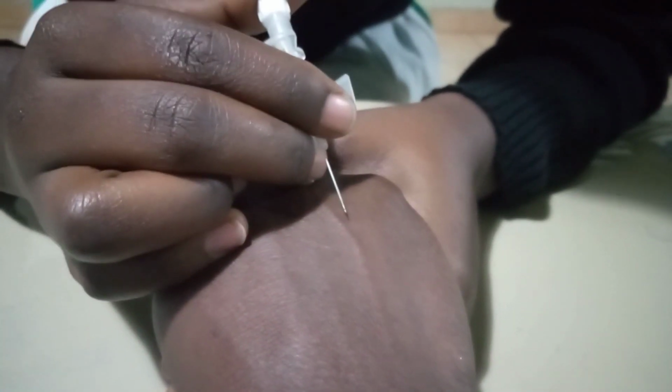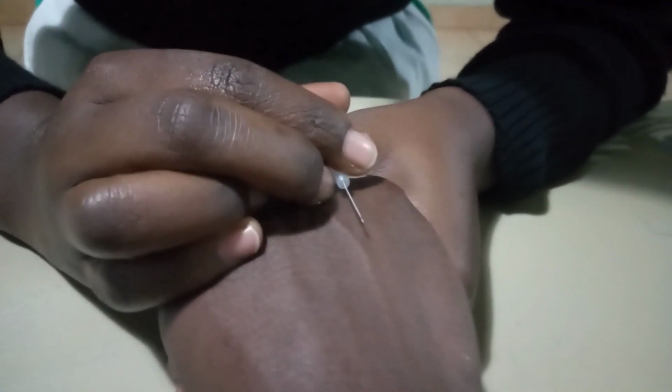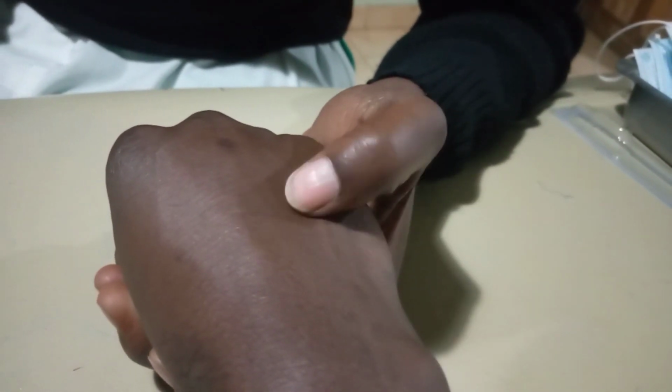So if the patient is round, you first go deep inside, then you straighten. If you go superficially, you're going to miss the vein and you're most likely to inflict a lot of pain on the patient. And for this case, this vein is very visible. In a round patient, you will not see the vein, and you must use your knowledge of anatomy and physiology to get to it. So that's why you have to go deep inside, because there is too much fat under the skin.